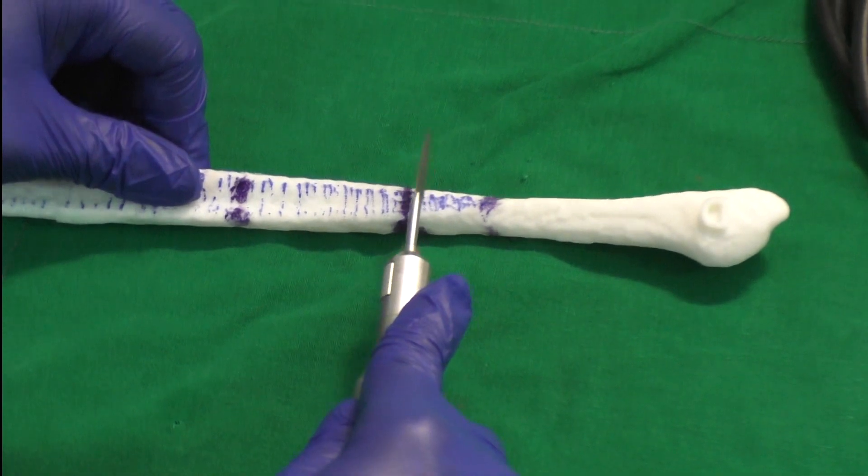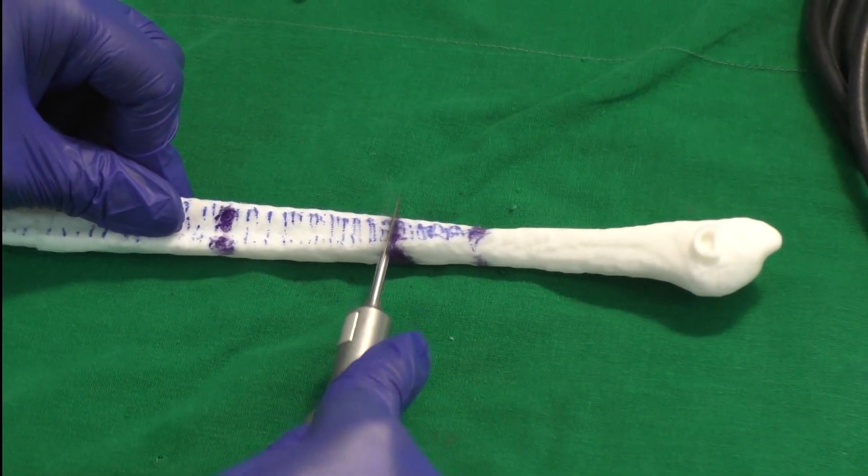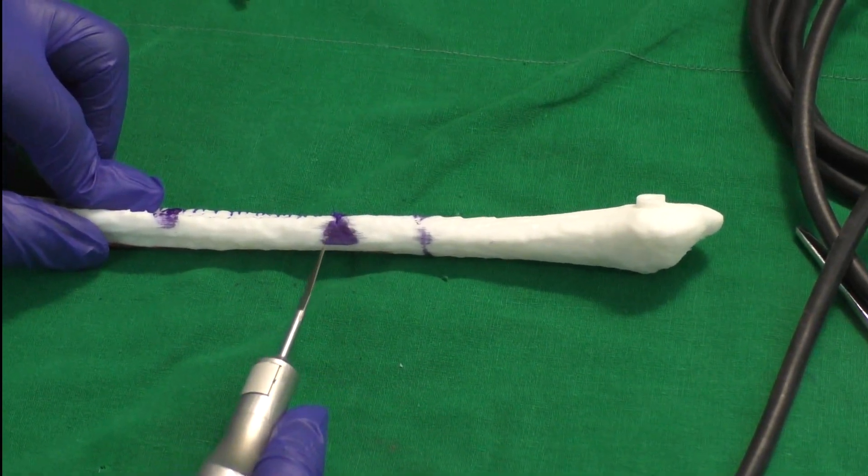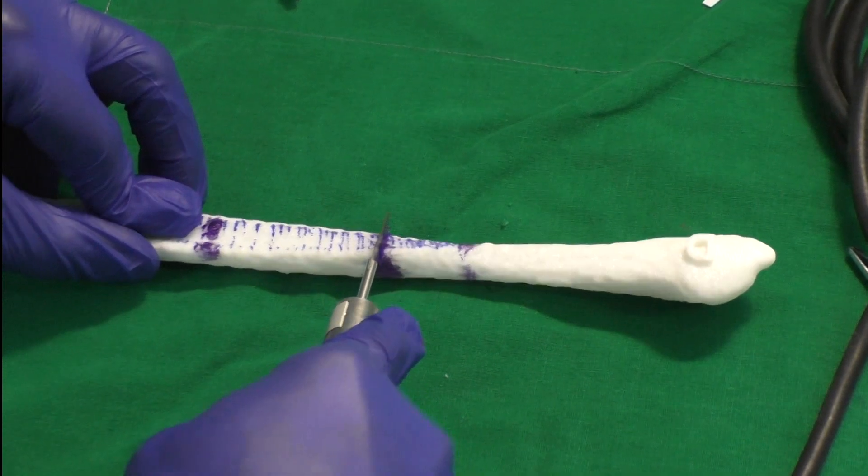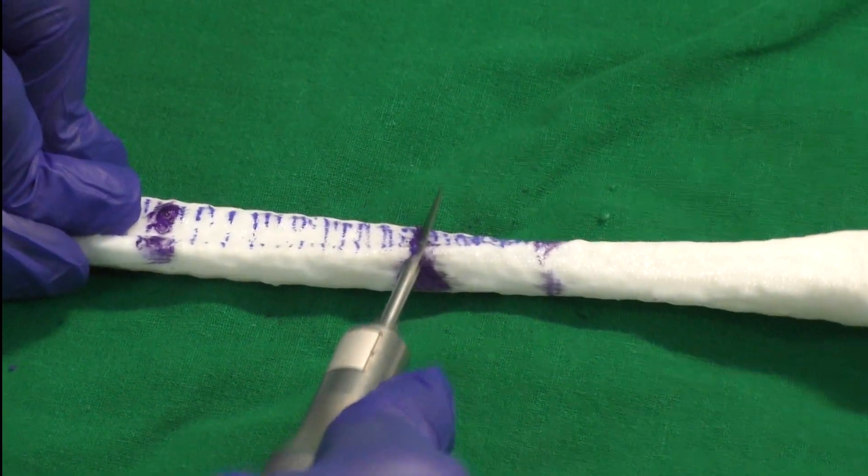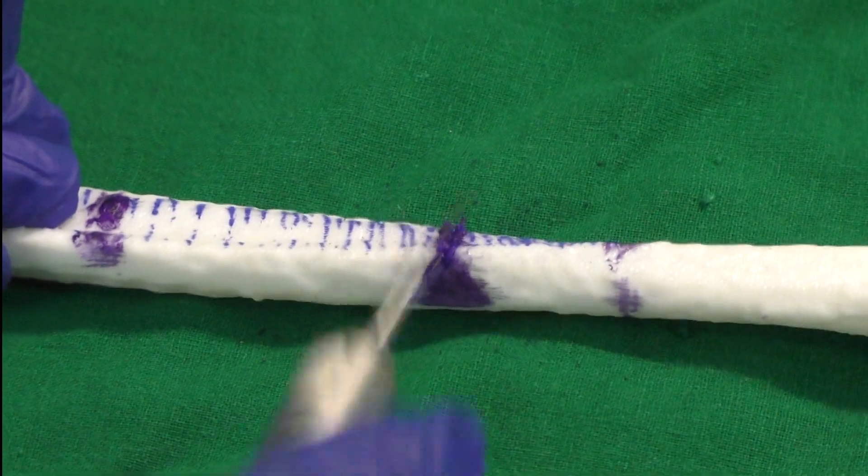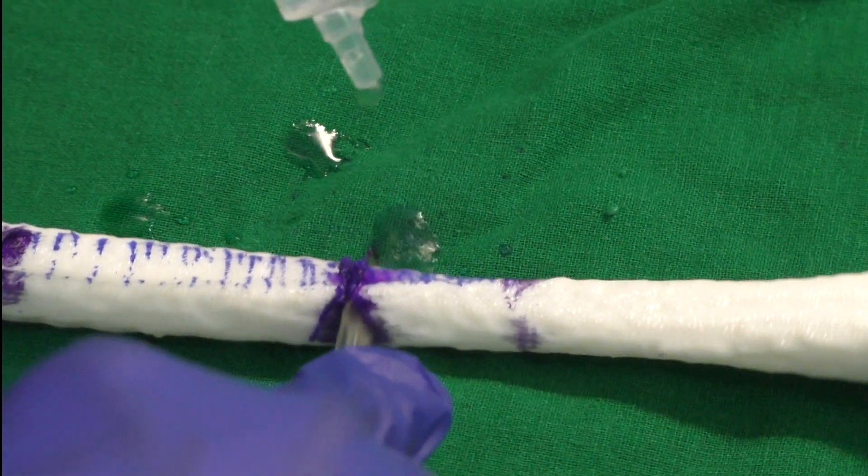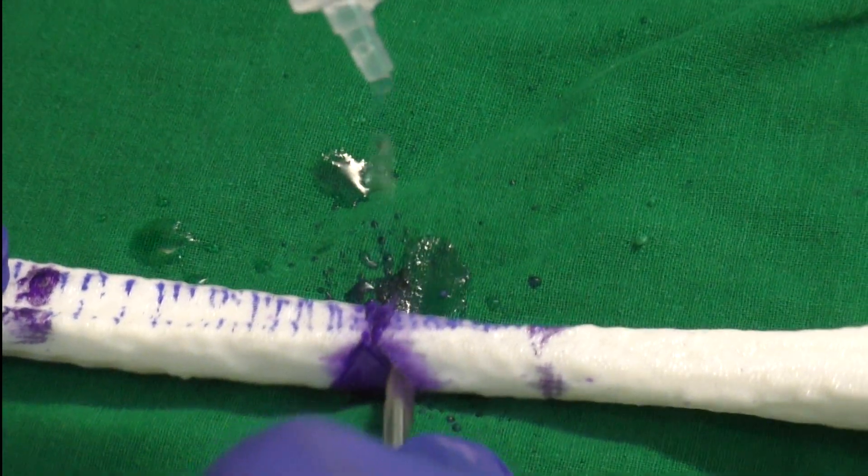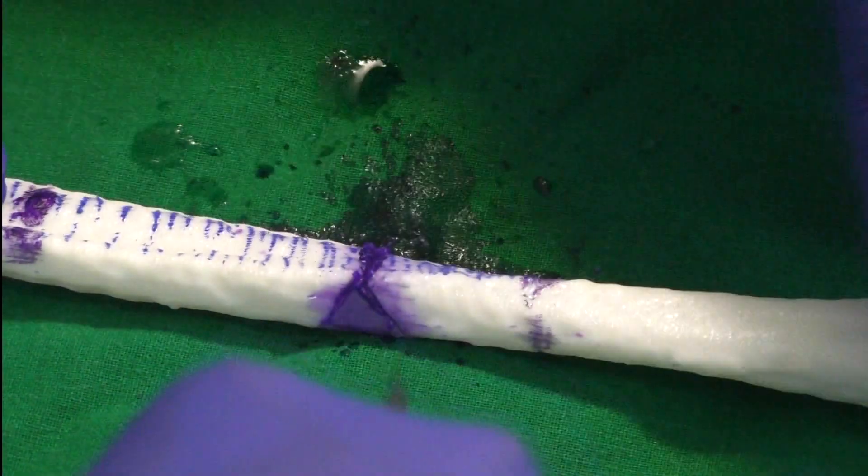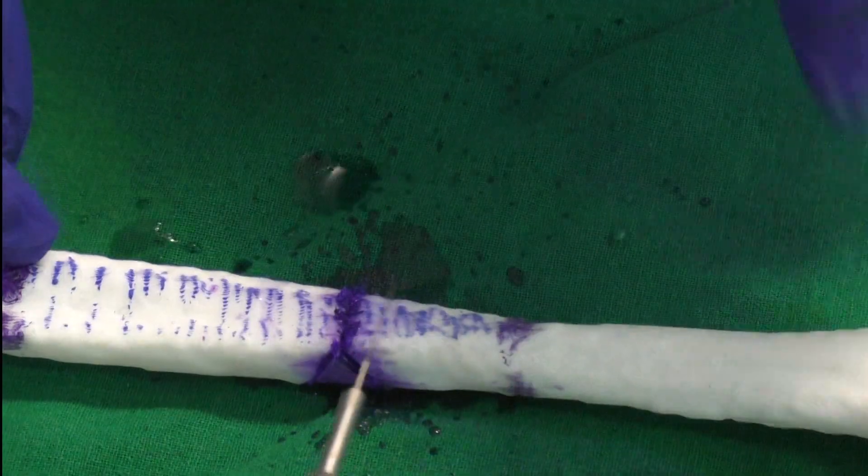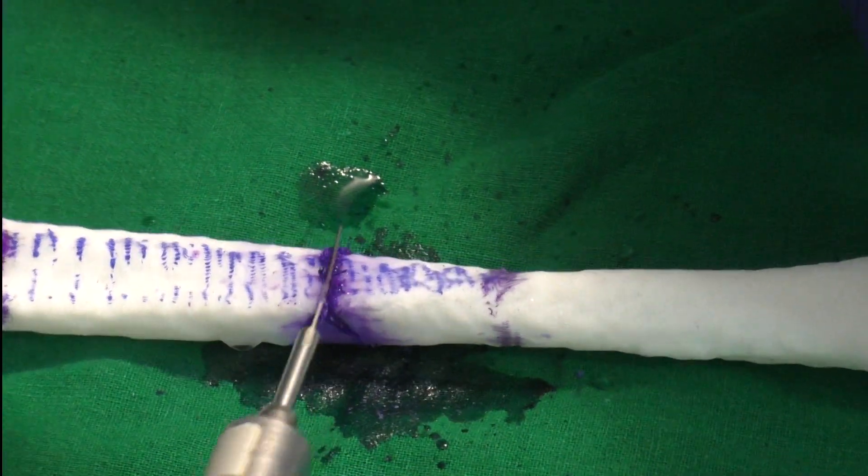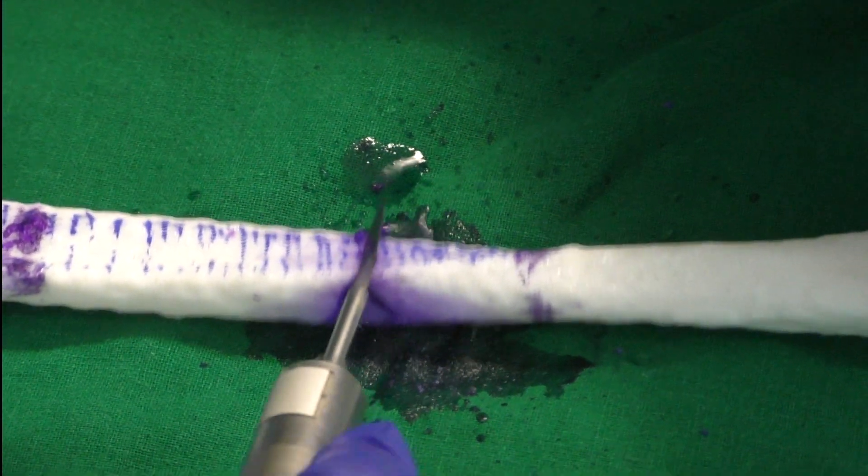So here's the osteotomy being demonstrated again. You start your osteotomy cuts vertically downwards for a few millimeters, and then identify which side you want to do first, and then tilt your saw towards that side of the osteotomy fragment. Then you come back up and then turn your hand towards the other side and go to the other side of the triangle. Since this is a 3D model there's a lot of splintering, but you can see that the triangle has formed and the base of the triangle is where the vessel would have been elevated in a subperiosteal plane.